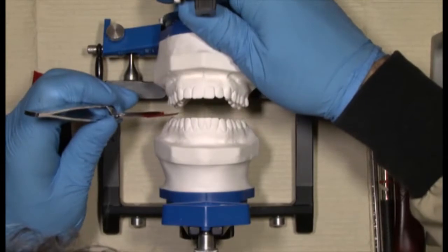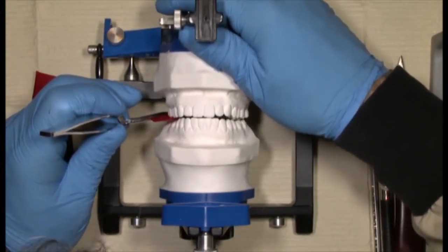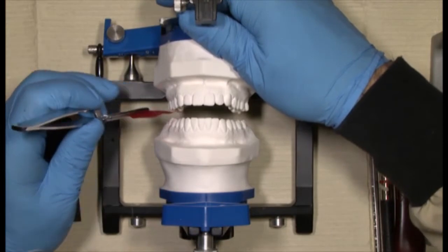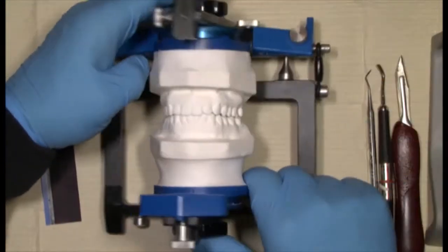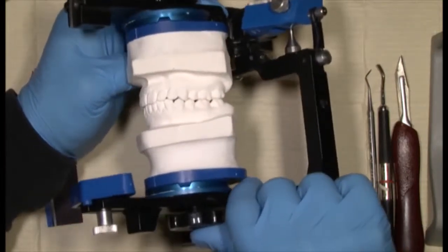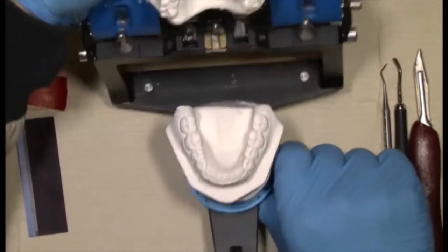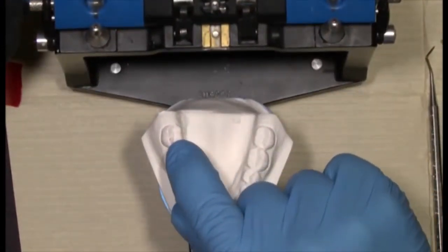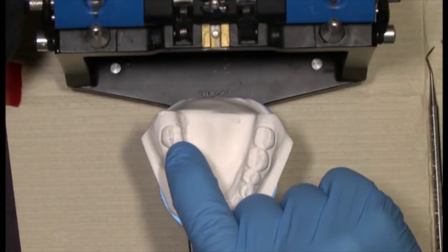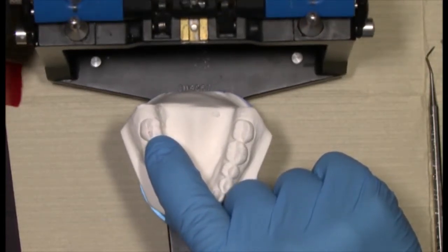So the first point, if we take the articulating paper and close the articulator up and down, the initial point of contact should be on the right side, and quite frankly, it's pretty apparent that the left side is actually out of contact. When I open the articulator, you can actually see the initial point of contact is in fact the lower right second molar, just what was pointed to by the patient in the video.